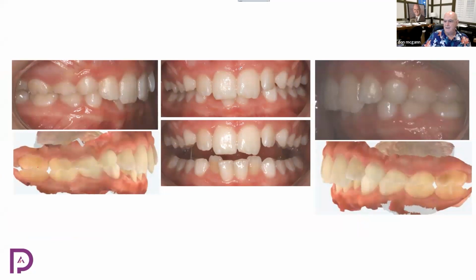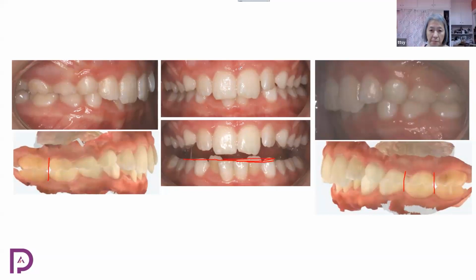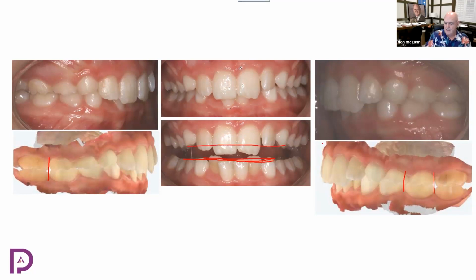And is this no, don't answer me. I shouldn't ask those questions. This looks like a mixed dentition class 1 from the terminal plane viewpoint here, right? If I draw a line right here, that's my terminal plane on the distal of the primary molars. So class 1 there, and maybe a little bit, oops, sorry, wrong one, right there, class 1 right there. Okay, so then, if I draw a little line across here, I didn't do that right. Cusp tip, I have some extrusion there. And I think this was the one that we did before. We draw a line there, we have some extrusion.